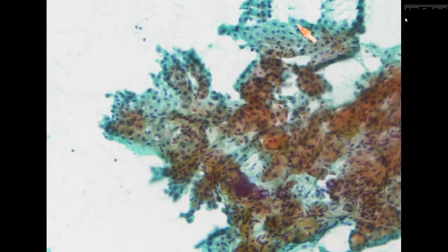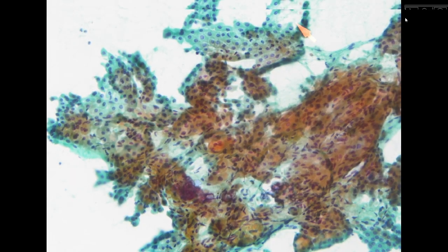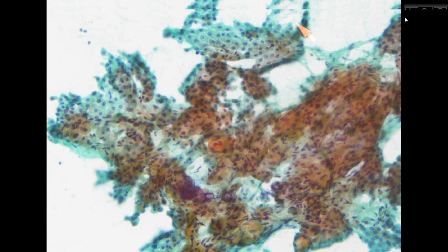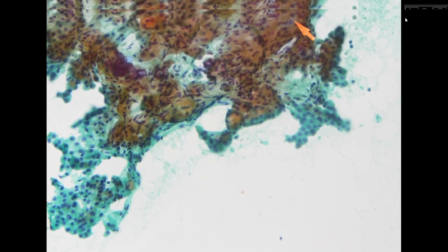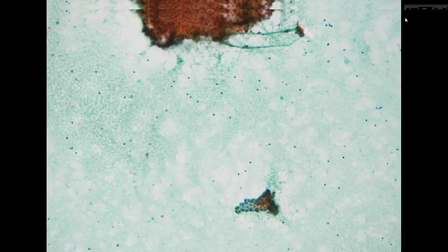The cellular component consists of predominantly oncocytic cells. So we have an oncocytic-rich predominant aspiration. In the background, there is no colloid, and we also do not see a lot of lymphoplasmacytic component. So most likely, it is an oncocytic tumor. So we will sign these out as TBS category 4, suspicious for follicular neoplasm, oncocytic type.